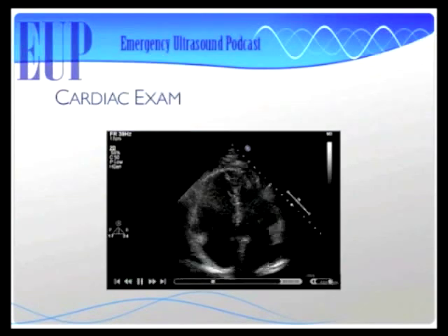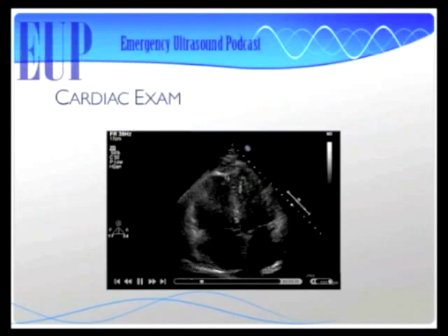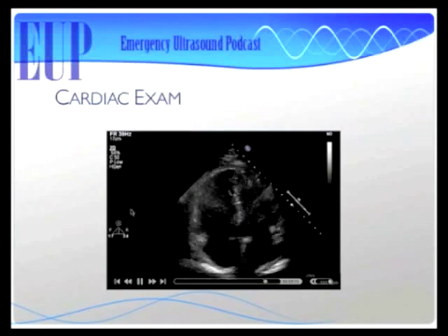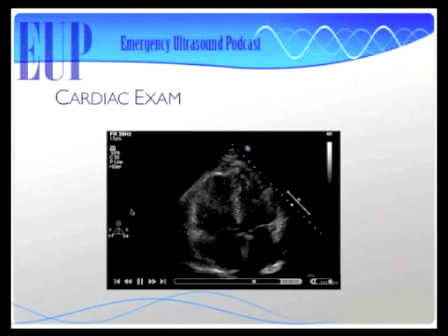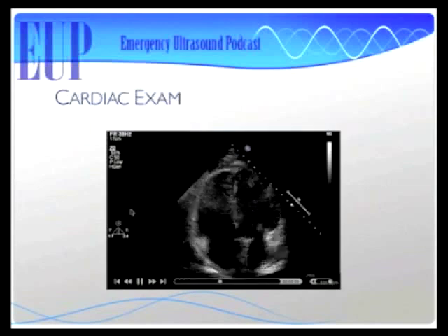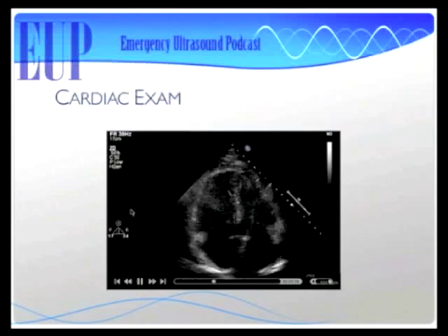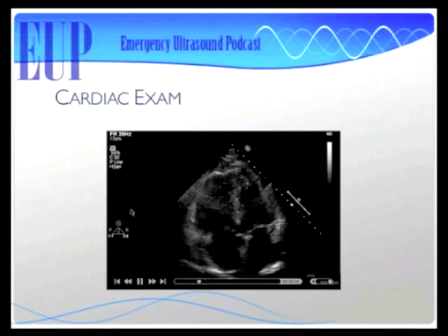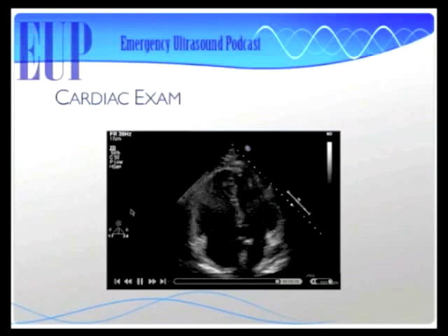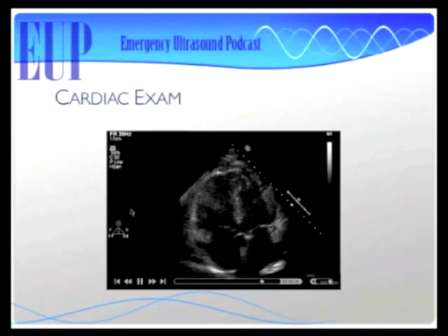Yeah, I see that. So this is something called a McConnell sign. McConnell sign was used for a while as an echocardiographic diagnostic criterion for pulmonary embolus. Basically, if you see the very tip of the right ventricle there on the left side of the screen squeezing down while the rest of the right ventricle isn't squeezing, Matt likes to call that the apical wink. It's also known as McConnell sign, where just the tip of the right ventricle is working, and it usually occurs when there's an acute cause of right ventricular overload. And I call it the apical wink.